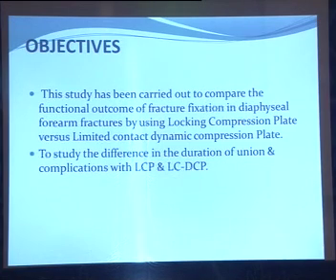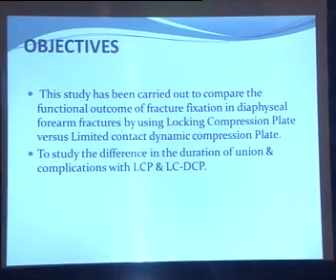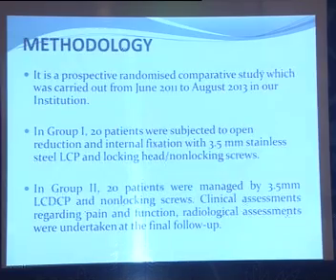Coming to the objectives, the study has been carried out to compare the functional outcome of fracture fixation of diaphyseal forearm fractures by using locking compression plates and limited contact dynamic compression plates, and to study the difference in duration of union and complications with LCPs and LCDCPs.